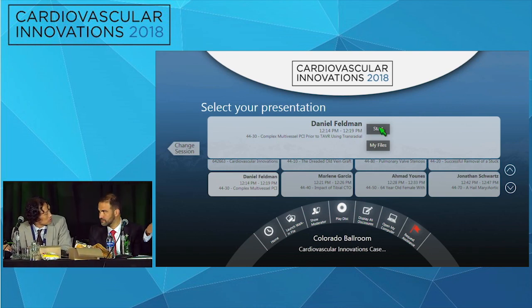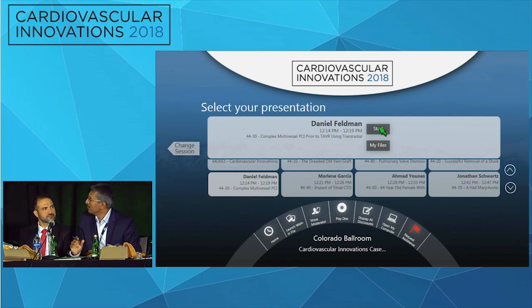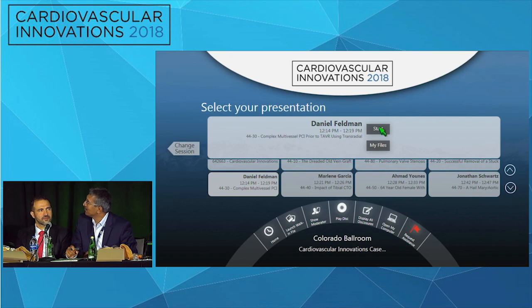So I have a question. I and Manas were discussing. Were you happy with the LAD stent result, or something more could have been done?